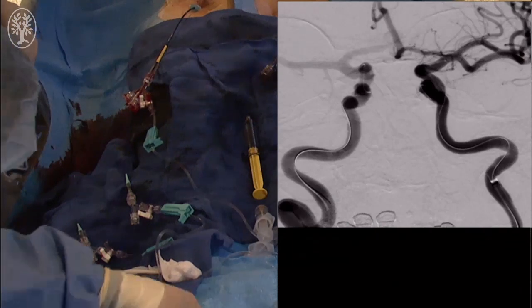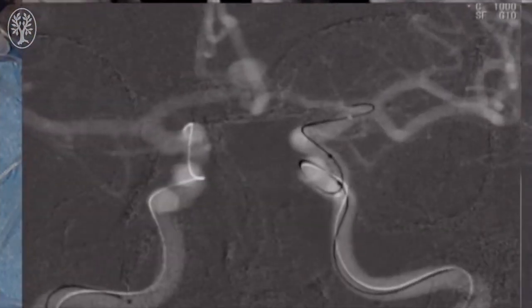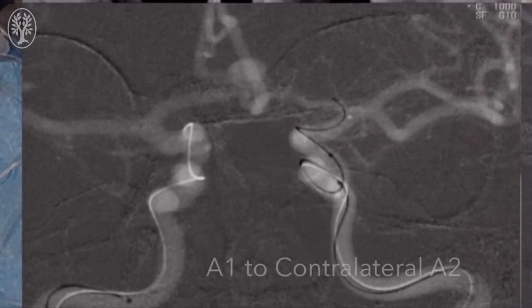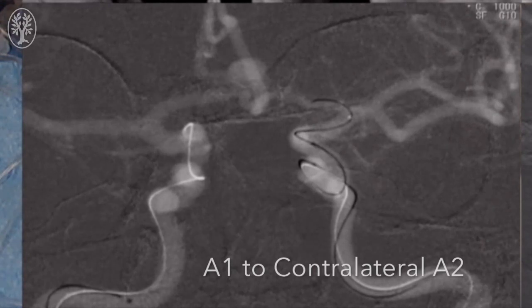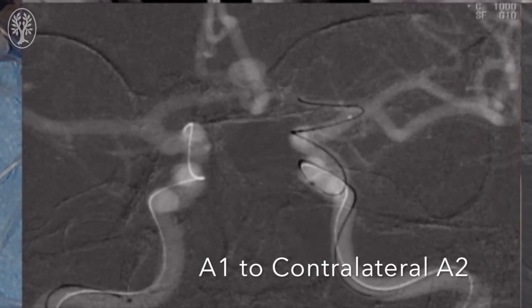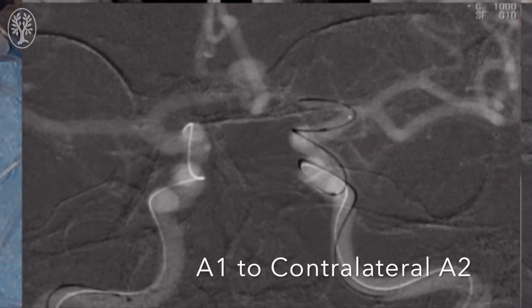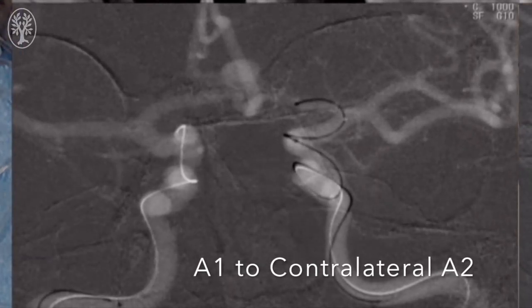Here we can see bilateral injections, and here once again we see the microwire accessing the left anterior cerebral artery in the A1 segment. Here we're going to go across the anterior communicating artery into the contralateral A2. You can see the microcatheter being tracked over the microwire, and now the microcatheter is in the A1 segment.